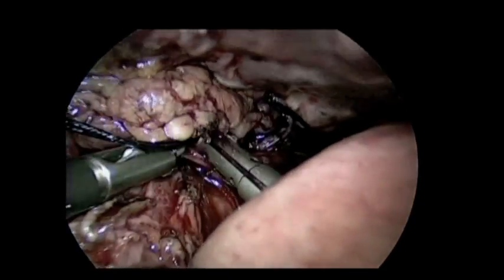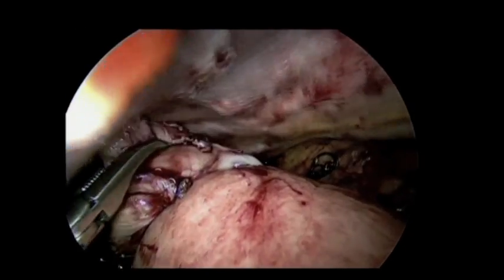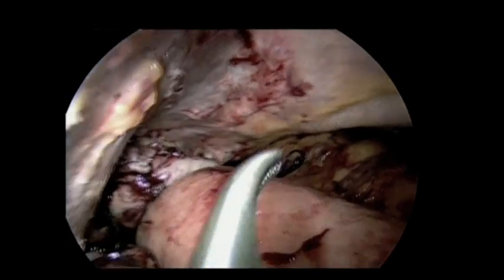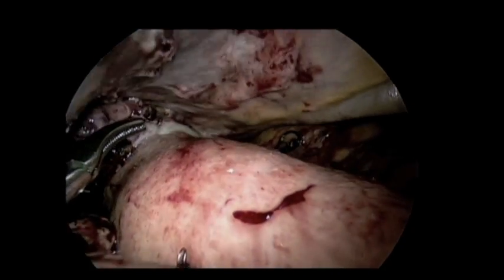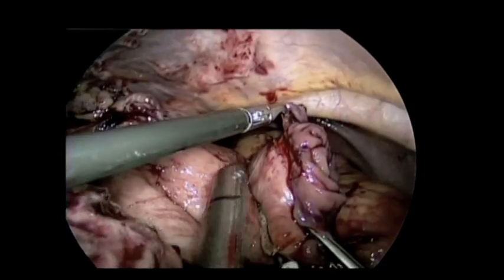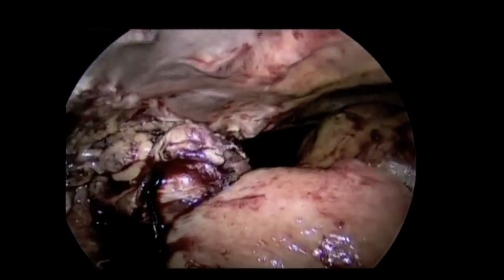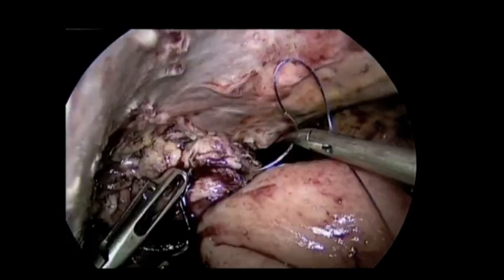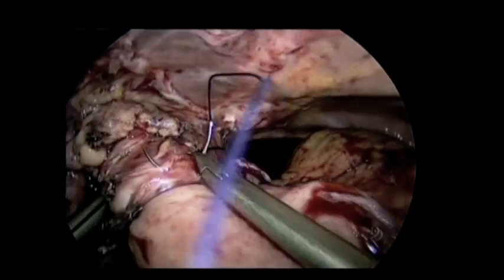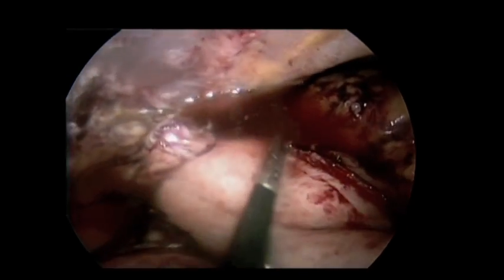It's locked now. We use the stay sutures to hold the esophagus and make sure it doesn't retract back. You can see it's tight as the saliva is pushed out, and it's fired. The stapler is slowly pulled back carefully. The opening on the jejunum was closed using a linear stapler and retrieved through the Endocatch bag. The anastomosis is done. We like to reinforce the anterior surface of the anastomosis with interrupted non-absorbable sutures — there's no data, it just makes us feel better in redo cases. Leak testing confirmed an airtight anastomosis.